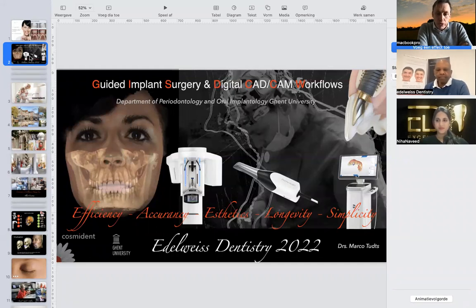How does it react if you have an opposing zirconium crown? That's also clear, I think. The zirconium crown is harder than the Edelweiss block, and you will get slight wear, not from the zirconium, but from the Edelweiss.